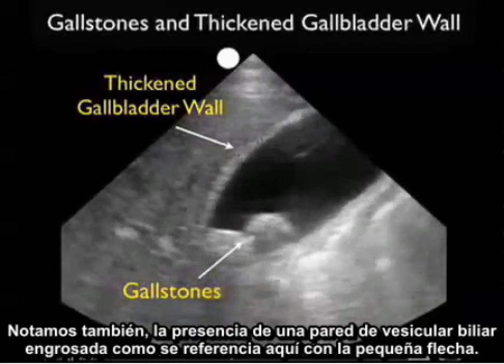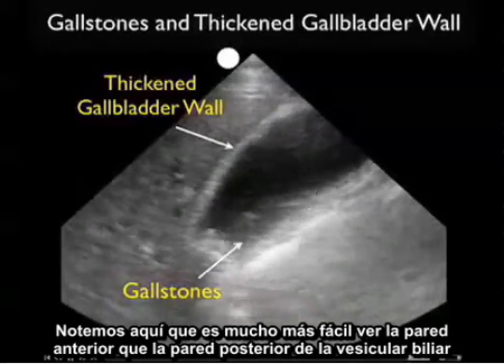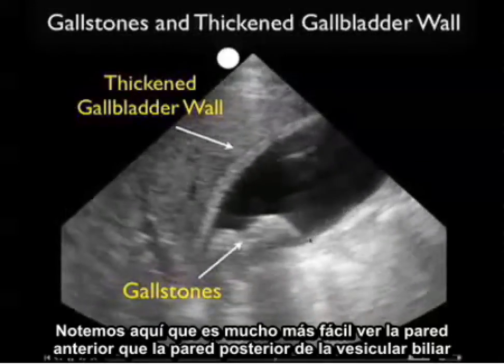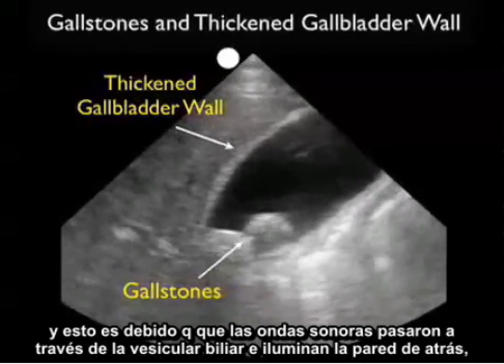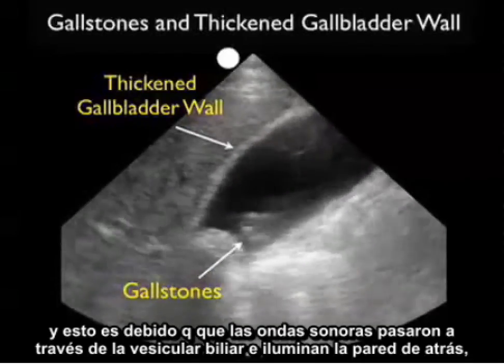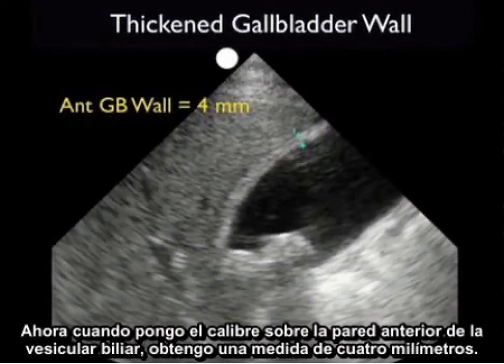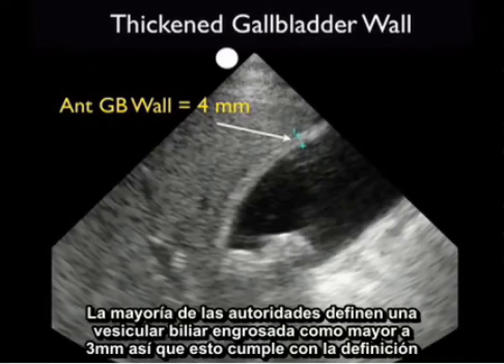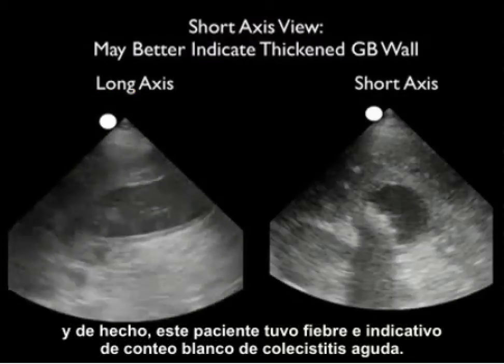Notice also the presence of a thickened gallbladder wall as referenced here with a small arrow. Notice that it's much easier to see the anterior wall than the posterior wall of the gallbladder, because the sound waves race through the gallbladder and light up the back wall, making it difficult to get a full sense of how thick it is. When I put the calipers down on the anterior gallbladder wall, I get a measurement of four millimeters. Most authorities define a thickened gallbladder wall as greater than three millimeters, so this meets the definition. In fact, this patient had a fever and a white count indicative of acute cholecystitis.